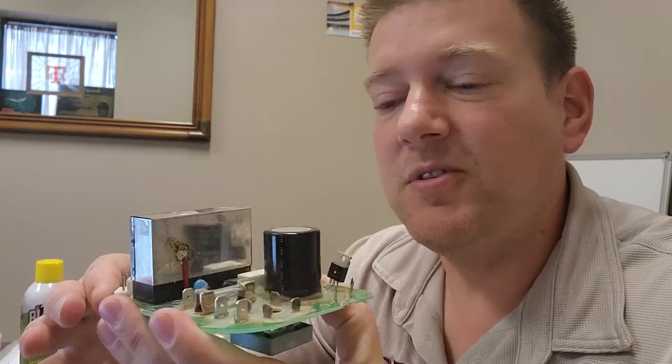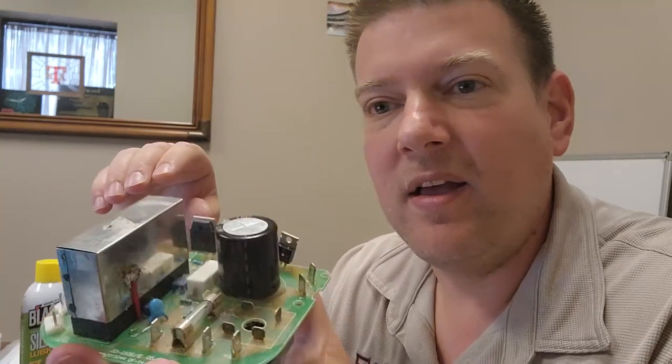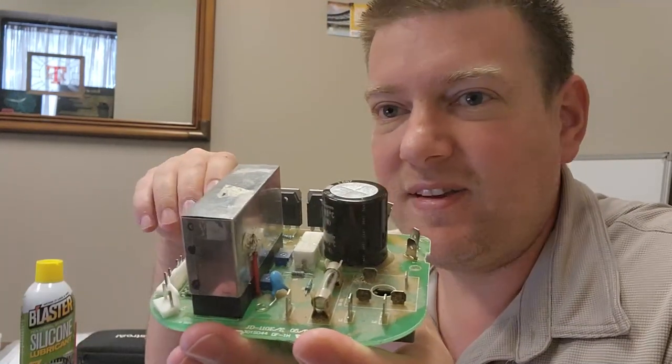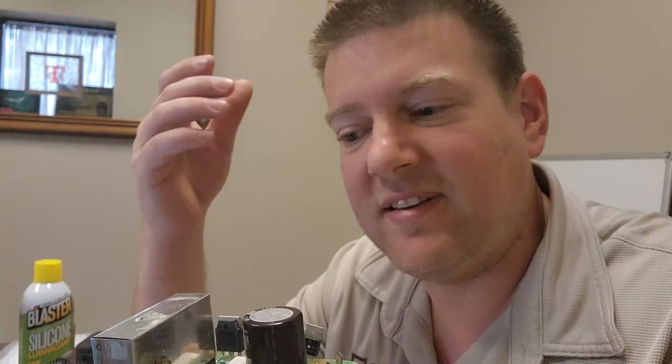But I went one step further and I wanted to check out the power supply itself. So this board right here, I can purchase for $175 online. It's kind of rare. Not too many people have them. And I thought there's no way. This board is not that complex. You can see, other than this guy in here, which I did desolder today, there's nothing in there that's too complex for me to really figure out. So I went ahead and checked it out.